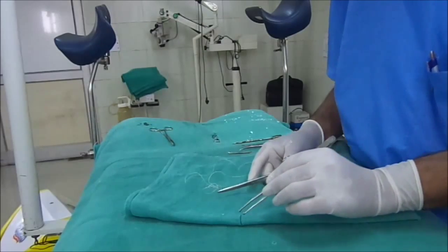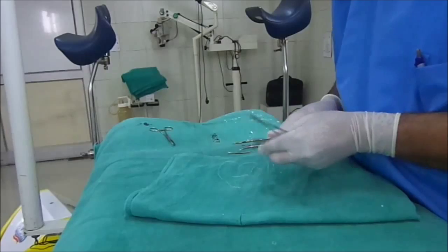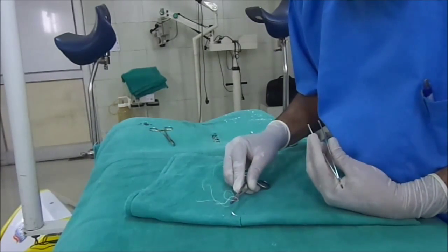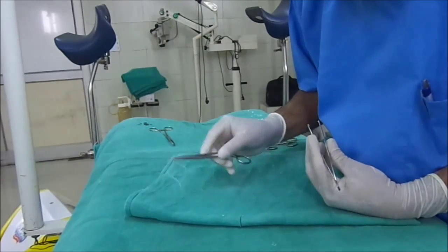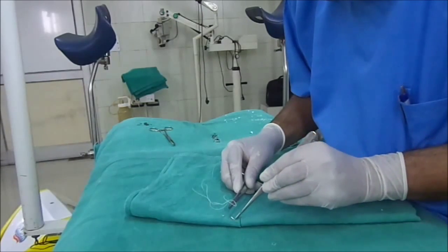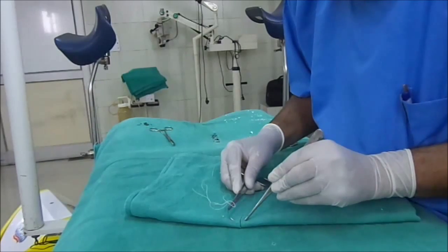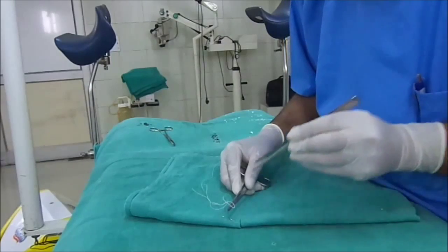So, first step. Just before making the suture, care must be taken that the bite on both sides of the edges should be the same. If I am going to prick the needle at a distance of 5mm from one side, then it should come out at exactly 5mm distance from the wound edge on the other side. Otherwise there is difficulty.